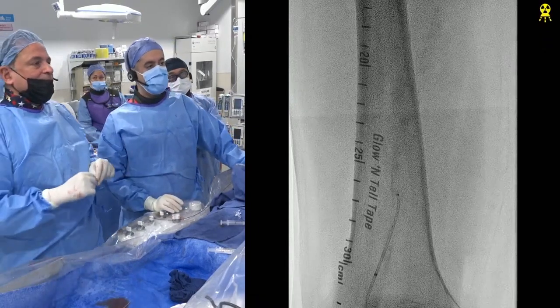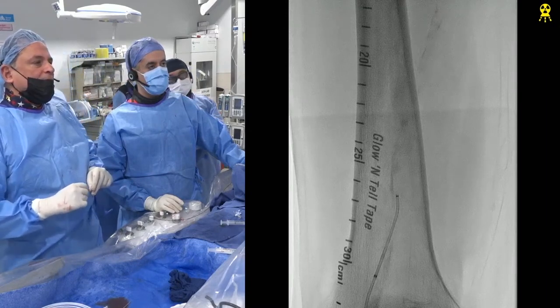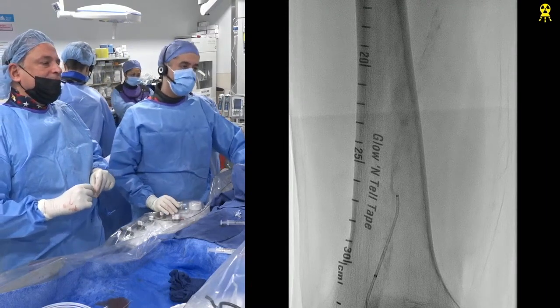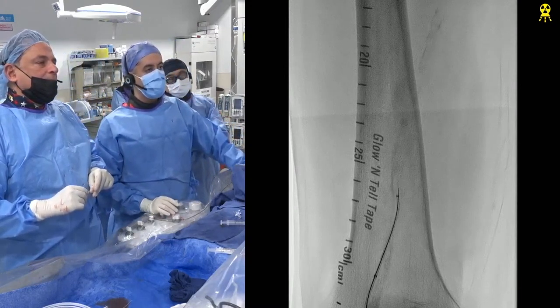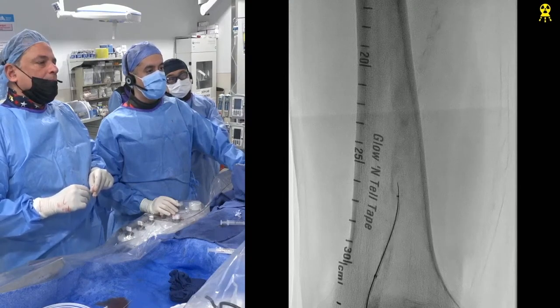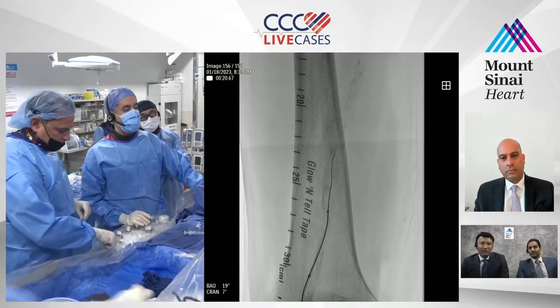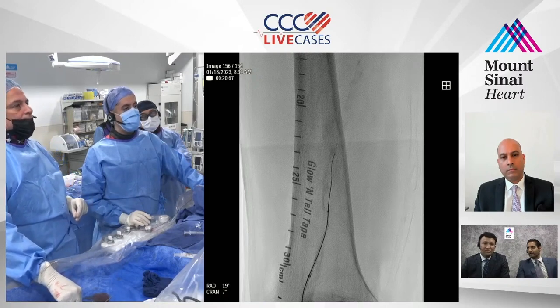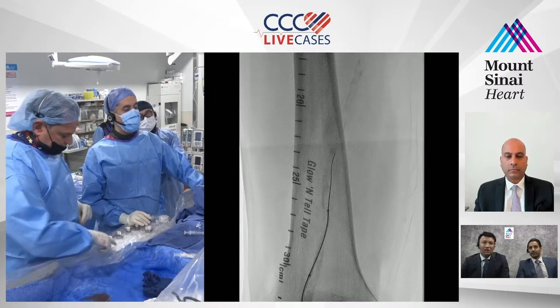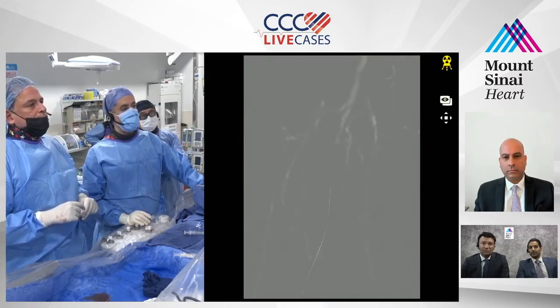I think just pull back a little bit more. Would you pre-dilate if you're going to use an Outback to help it track, with this amount of calcium? Yeah, especially with that eccentricity we took right at the proximal pop, the P1 segment. I don't think our Outback is going to go through that bend. I don't know, the Navicross popped in quite seamlessly. It's a hydrophilic catheter, but the plane we created was efficient enough. That's what PK did, bury the Navicross in so that we could find a nub and hopefully push it through.